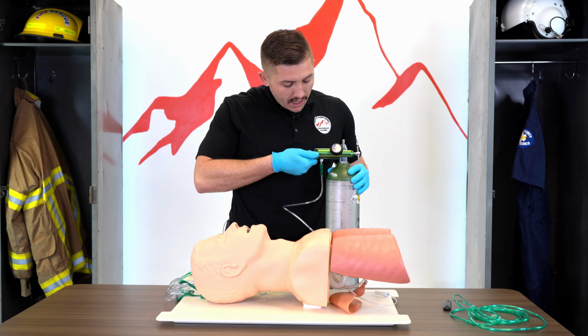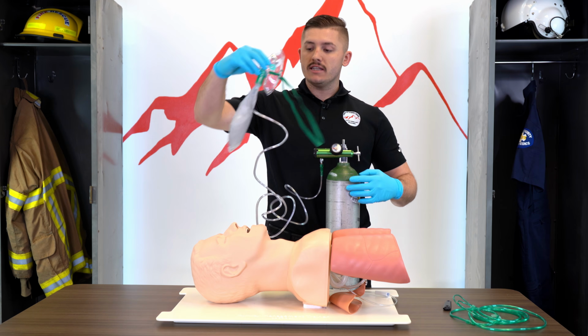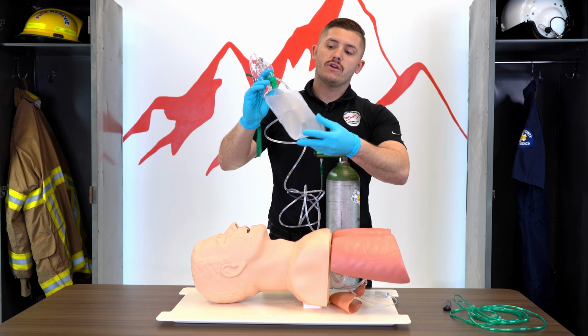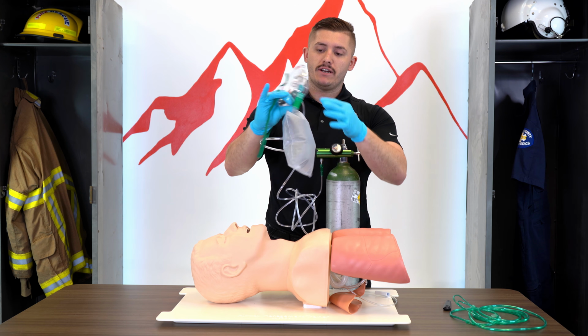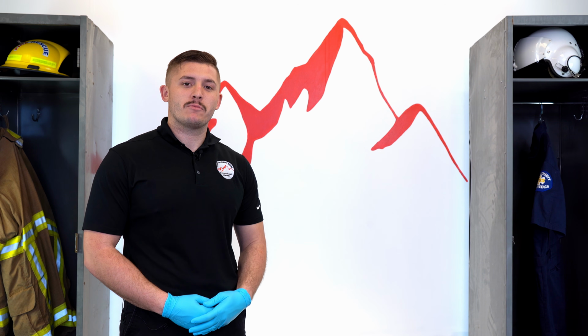So I'm going to change my dial. Right now we're at 10, and you guys will see this bag starts to inflate. So I want to make sure this bag is completely inflated or full of oxygen before I place it on my patient's face. So now, okay guys, now we'll demonstrate placing a nasal cannula and a non-rebreather on an actual patient.